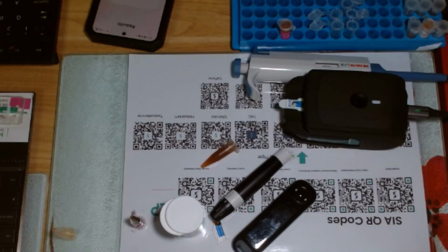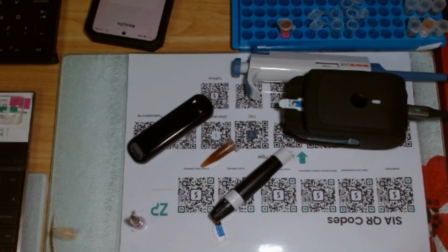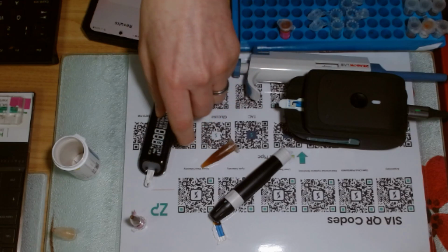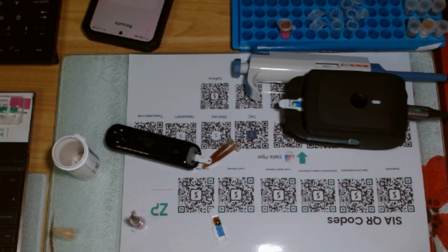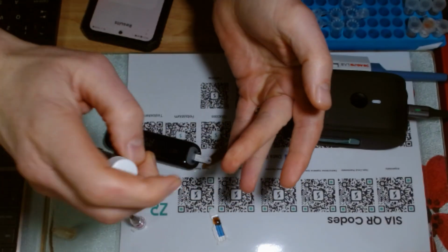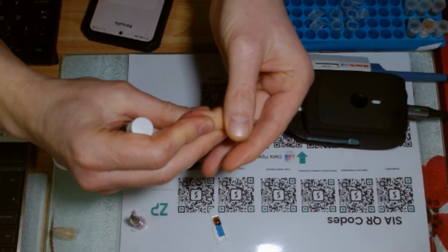You will notice that a lot of the features of these glucose strips are really similar to what happens in the FoodSense Generation 4. So that's on, and I'll just get the sample. Maybe I should have pushed a bit harder.